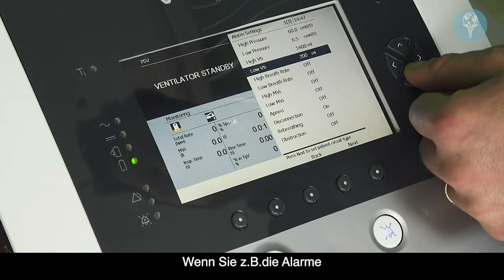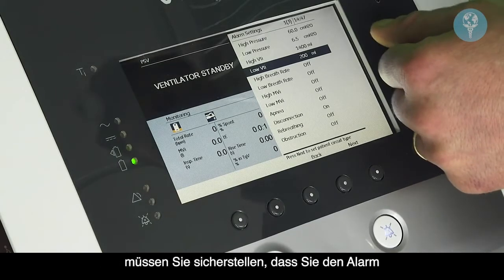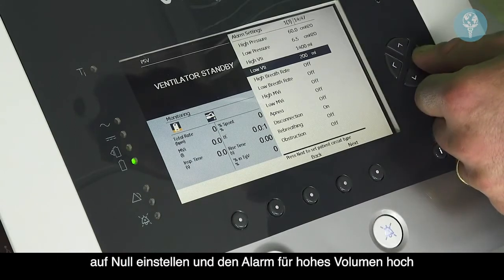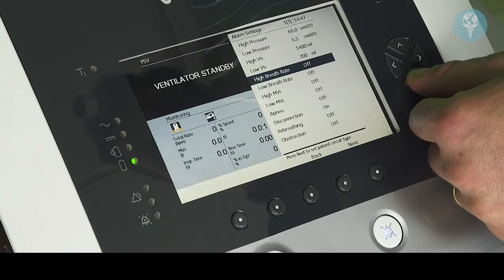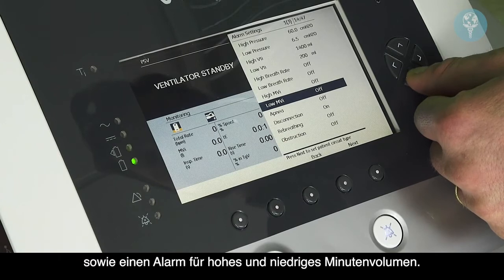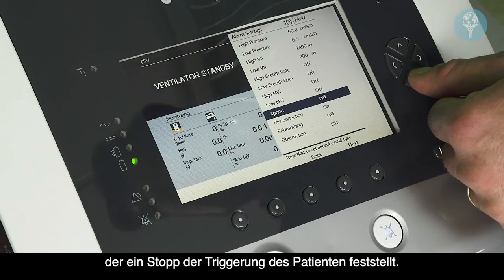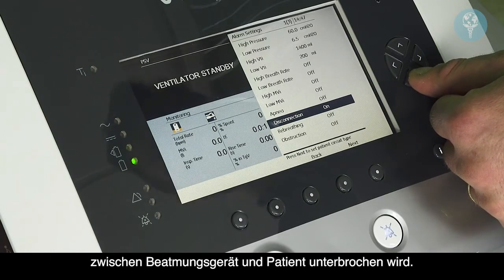So for example, if you want to deactivate the high and low volume alarms, just make sure that the low volume alarm you set downwards to 0 and the high volume alarm you set up to its upper limit of 3,000 millilitres. You have a high and low breath rate alarm, a high and low minute volume alarm as well, an apnea alarm which detects a cessation in triggering of the patient, a disconnect alarm if the circuit becomes disconnected at any point between the ventilator and the patient.